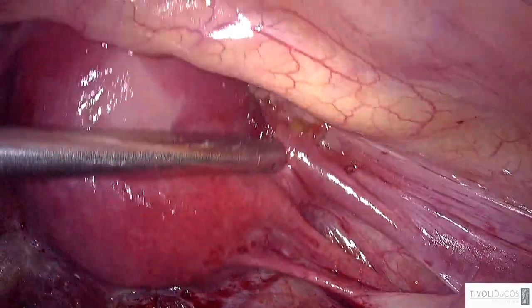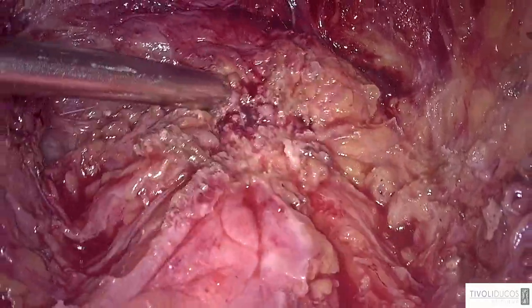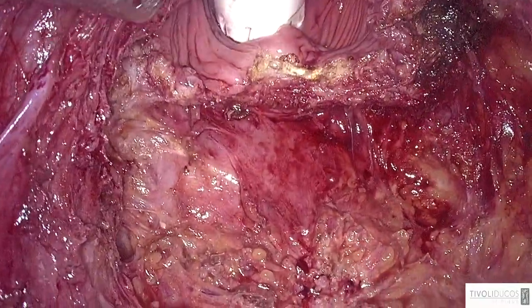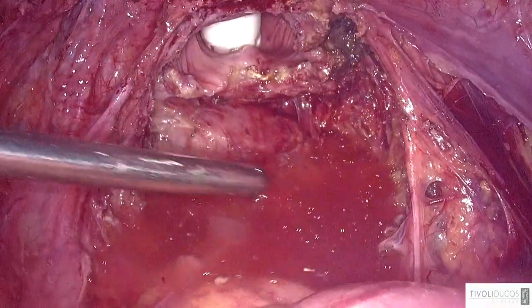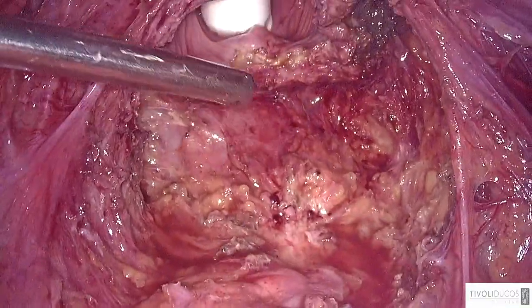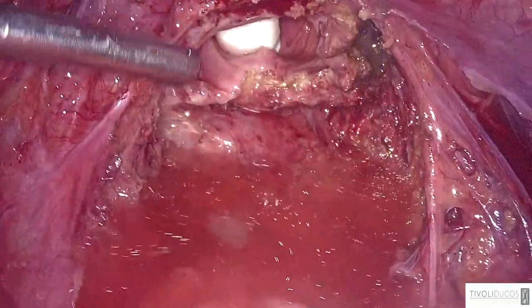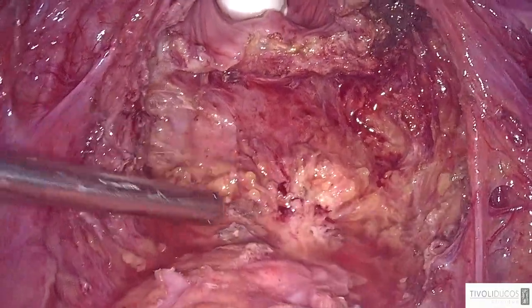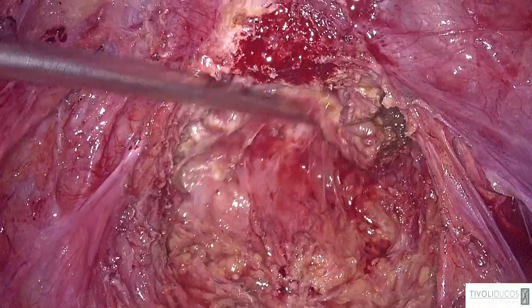Then we'll remove this nodule, and at the end I will clean the rectum. We'll dig into the rectum to render it feasible for a disc excision, and I am sure we'll be on time with this surgery. And I will keep you informed about the evolution, because tomorrow we'll remove the bladder catheter, and once the bladder catheter is removed, we routinely carry out the bladder scan to see how the bladder voids.